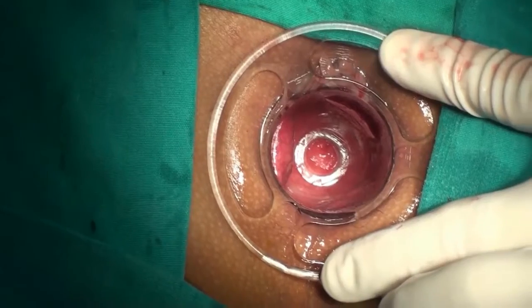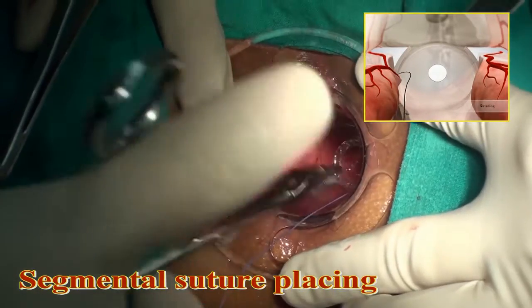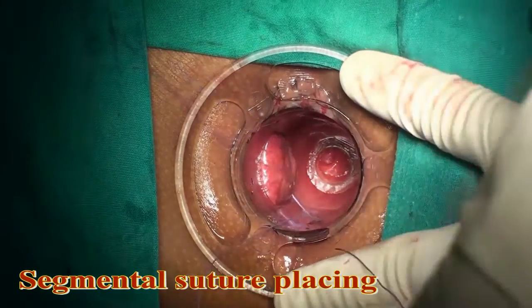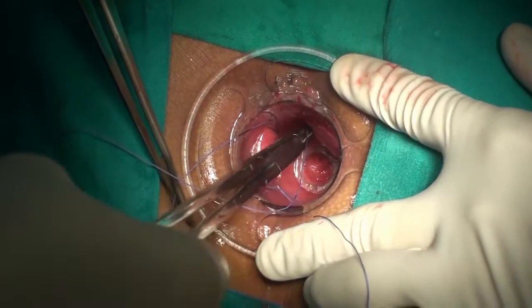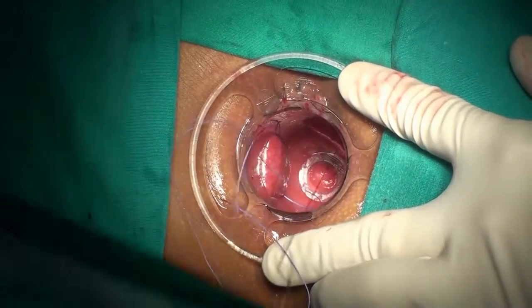A 2-0 Vicryl suture was placed approximately 3 centimeters above the dentate line, catching the mucosa or submucosa protruding through the window.